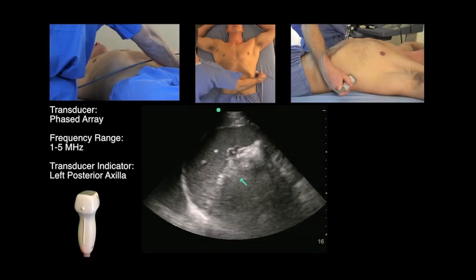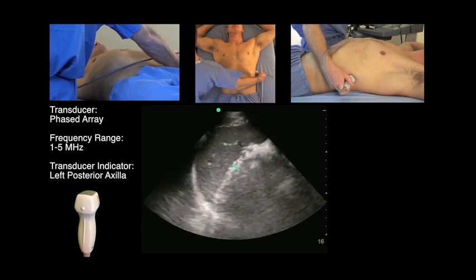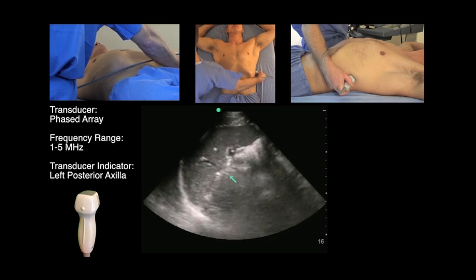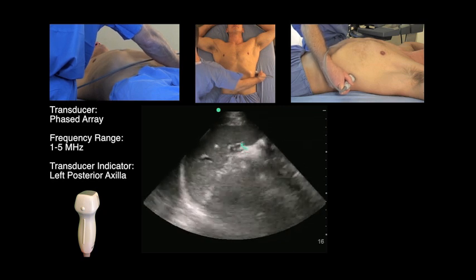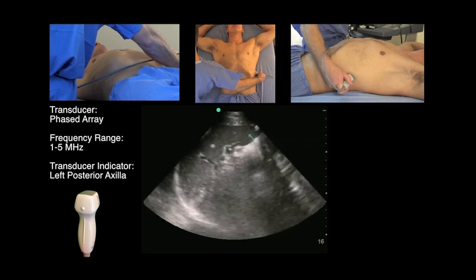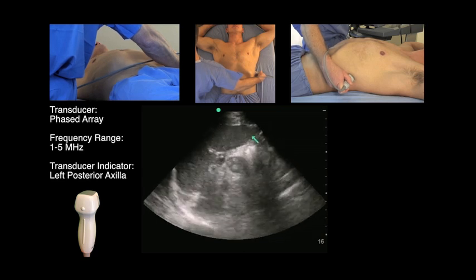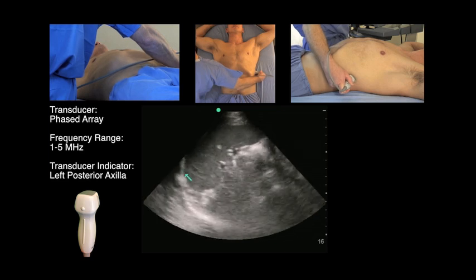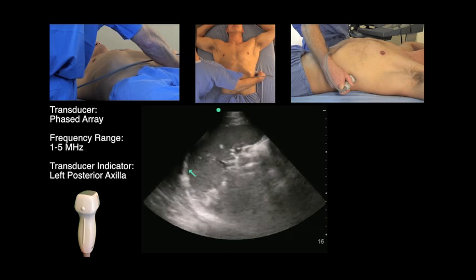In the left upper quadrant, what we're interested in is what we often call the perisplenic view, and we're not so interested in the kidney on this side because there's not a potential space between the kidney and the spleen like on the right, like there is between the kidney and the liver. Where we're trying to look is at the lower tip of the spleen here and looking for a little cap of fluid around there, and then we're looking for the space between the diaphragm and the spleen here.